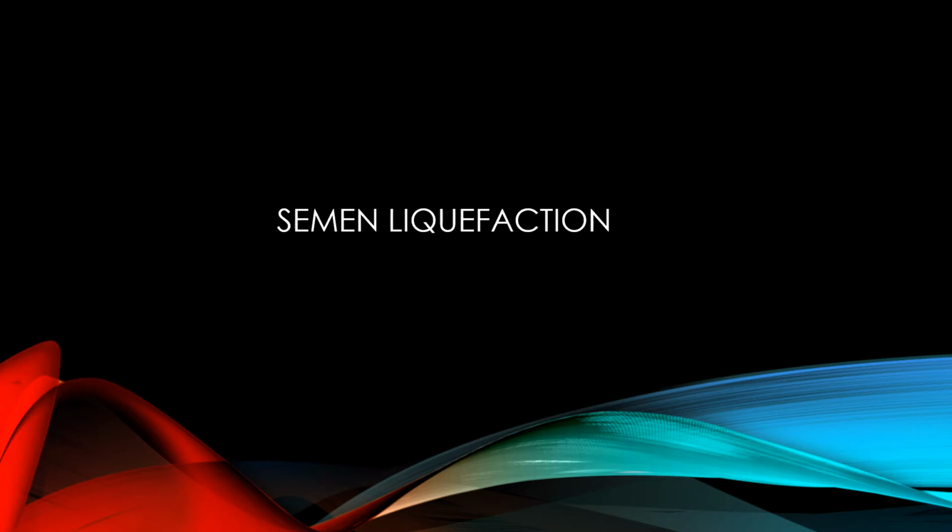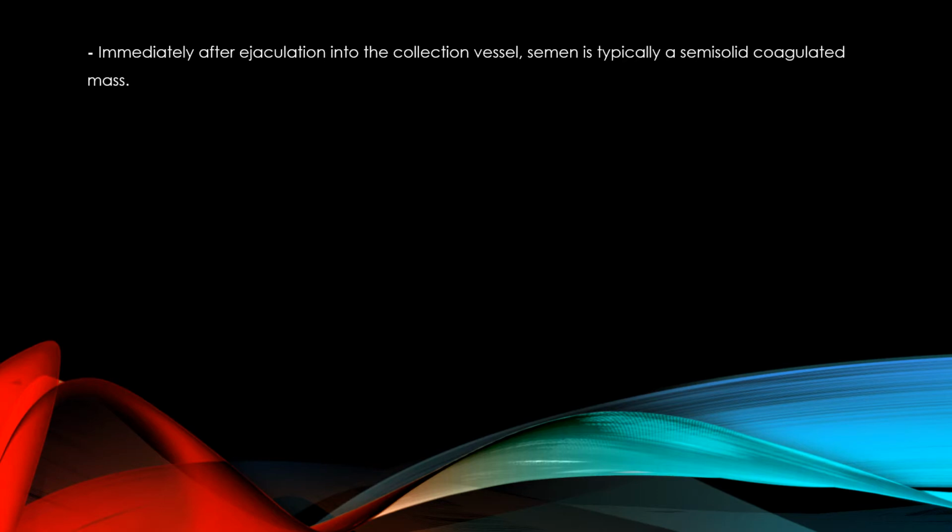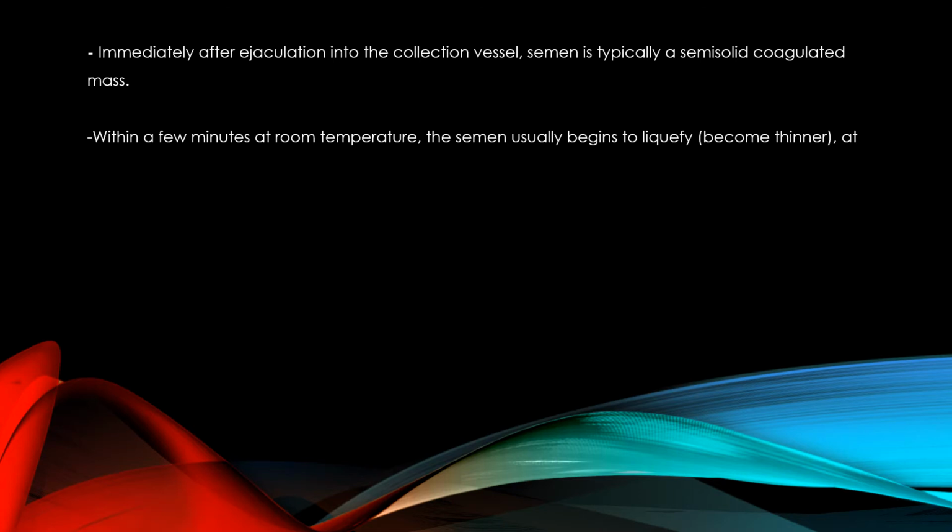Semen liquefaction. Immediately after ejaculation into the collection vessel, semen is typically a semi-solid coagulated mass. Within a few minutes at room temperature, the semen usually begins to liquefy. That means it becomes thinner, at which time a heterogeneous mixture of lumps will be seen in the fluid.